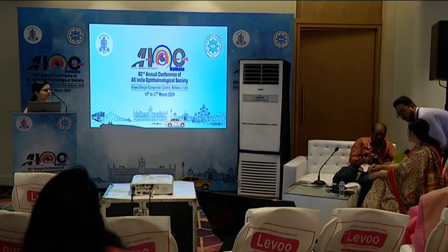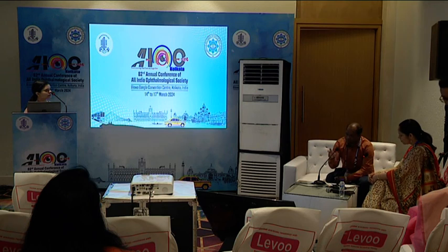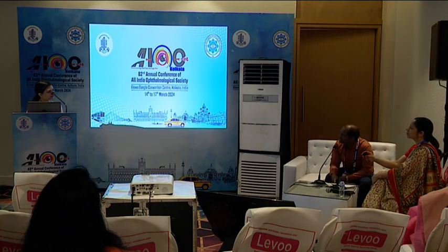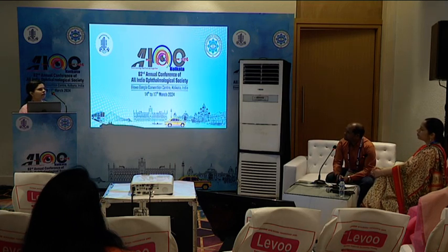Okay, I will hand over this. Sir, want to ask anything? Can you go for a Malyugin ring or BHEX ring in those cases, sir?